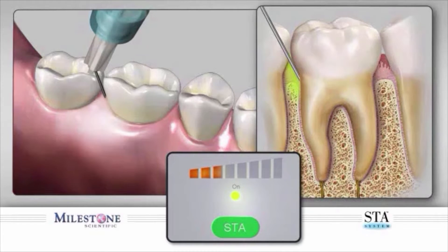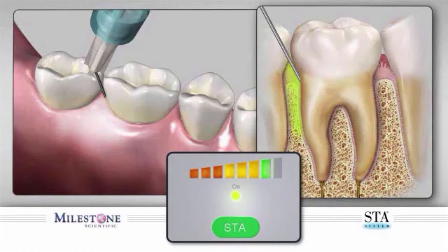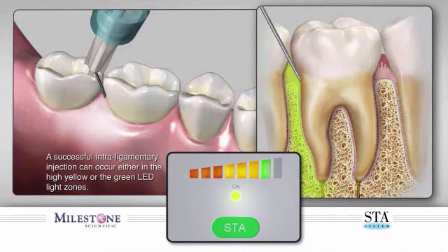Advance the needle forward slowly into the sulcus, moving the needle gently down until you reach resistance. Maintain an approximately 45-degree angle while holding the needle in place with minor hand pressure. Do not use excessive hand force on the needle, as this may block the flow of solution into the tissues. Carefully control and stabilize needle movements using the finger rest. Once you feel you're at the base of the sulcus, minimize any movement for 10-15 seconds as the Dynamic Pressure Sensing Technology starts to analyze your position.